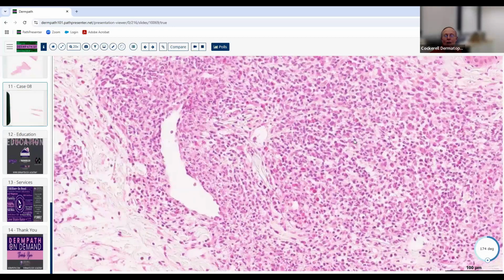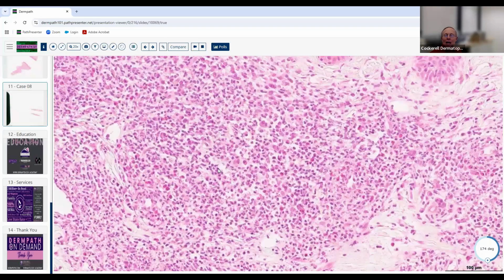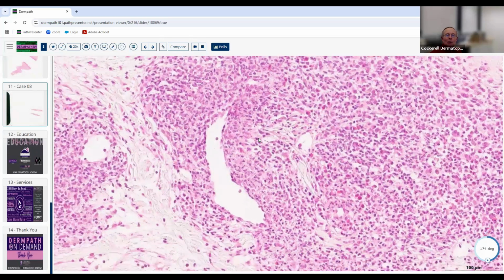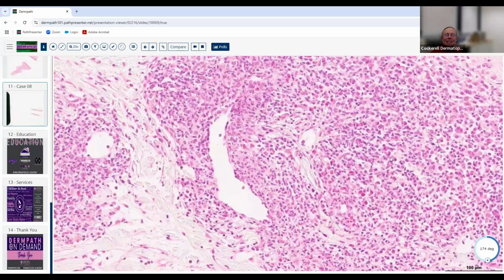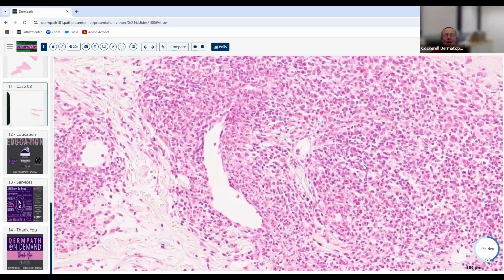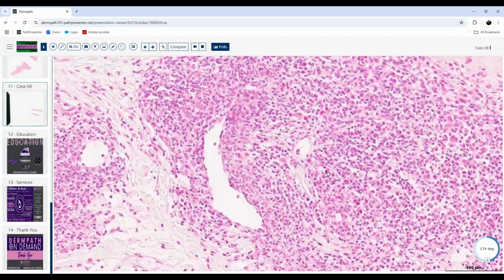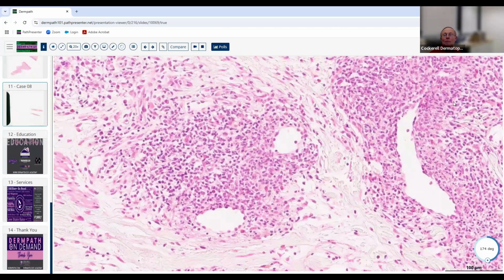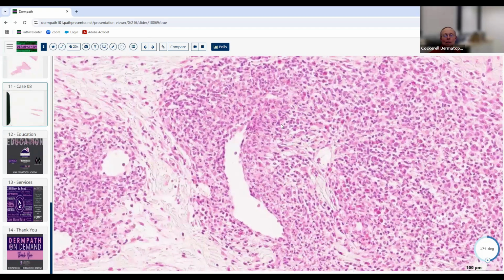It's beautiful. And they're going to show you something like this if you get this on the board examination. Now, see if you were listening to me earlier. What looks exactly like this under the microscope, but it isn't Granuloma faciale? EED? Okay, good. Yes, that's the histologic identical twin of this condition. It looks almost identical to it, but it's not on the face. So if you see this pattern on the face, it's Granuloma faciale. If you see it on the hand, it's EED.